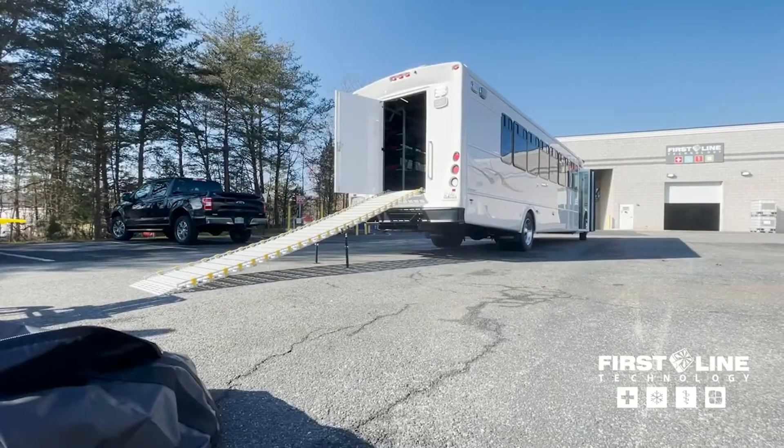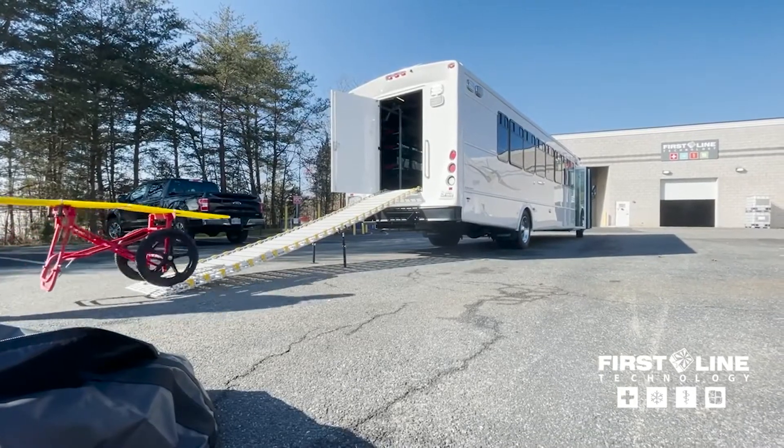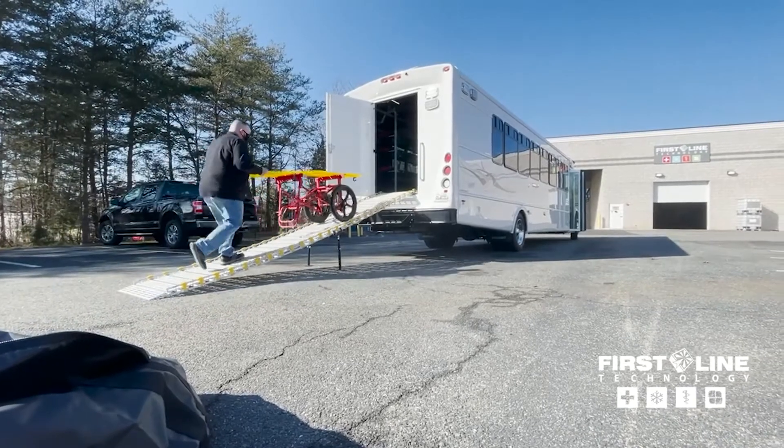In the back of the bus, we have our AmbuRamp set up, where you can bring patients in and out using our AmbuCarrier.